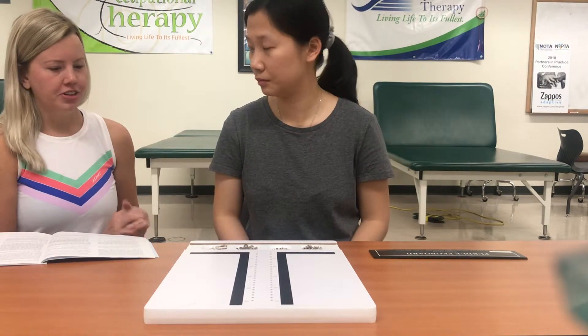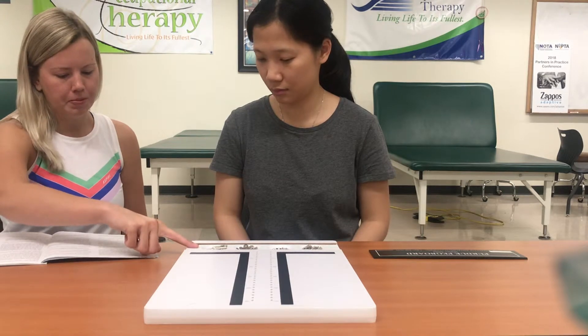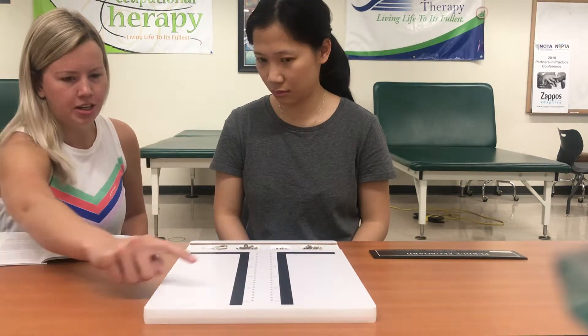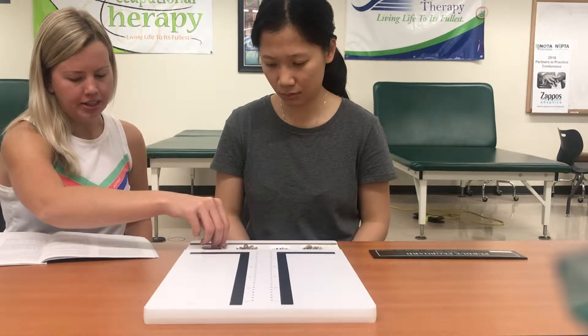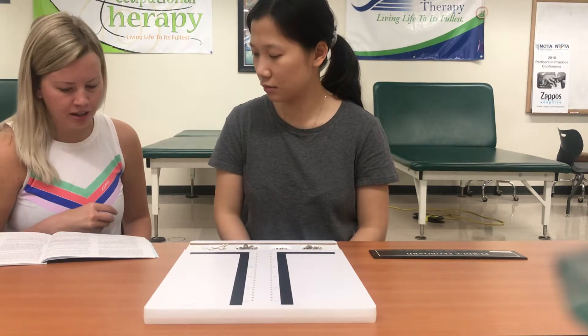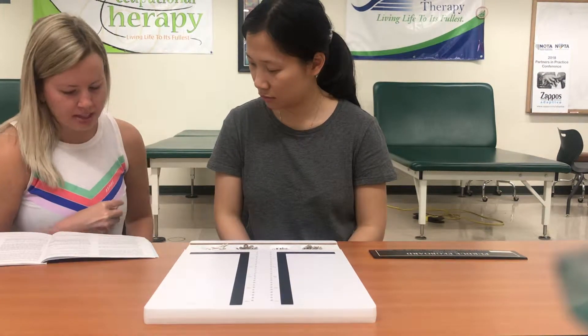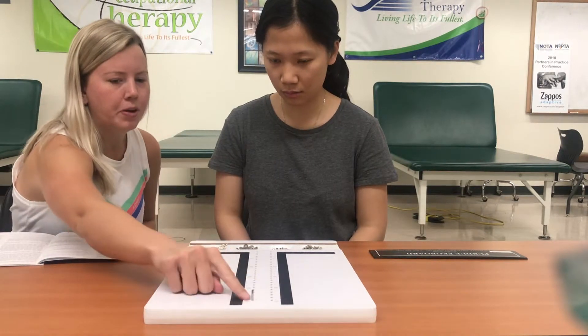Be sure you understand exactly what to do. For this first test, you're going to pick up one pin at a time with your right hand from the right-handed cup. Starting with the top hole, place each pin in the right-handed row. Now you may insert a few pins for practice. If during the testing time you drop a pin, do not stop to pick it up — simply continue by picking up another pin from the cup. So top row, right hand.